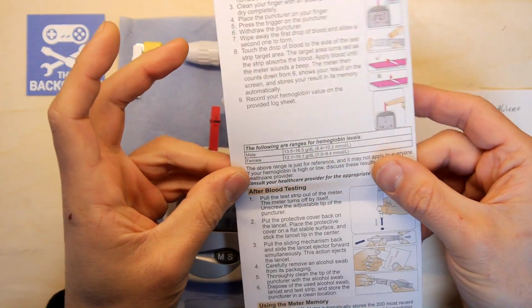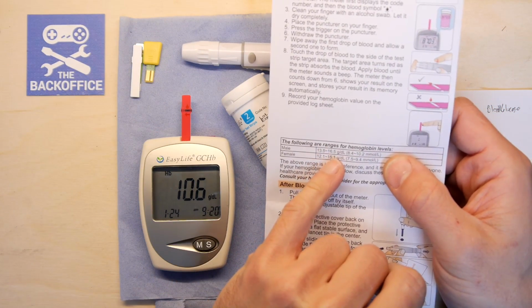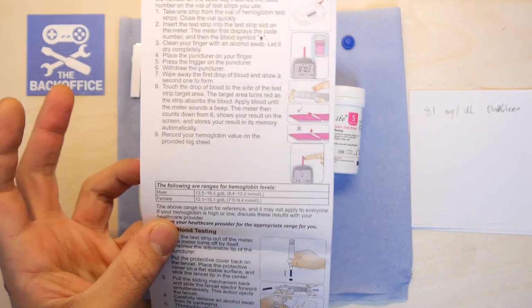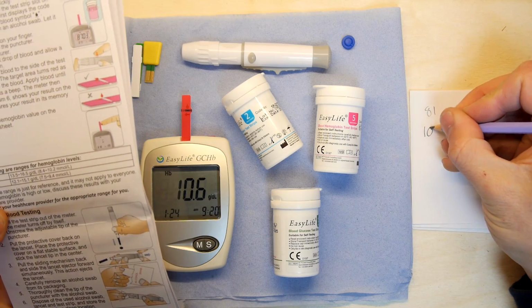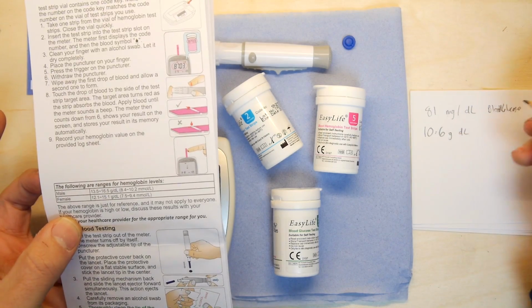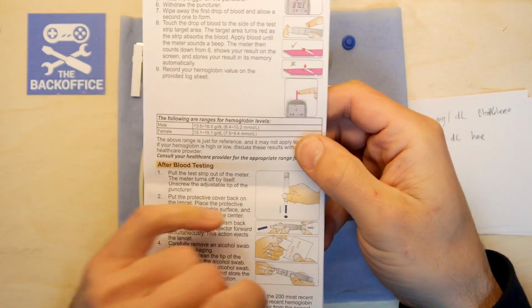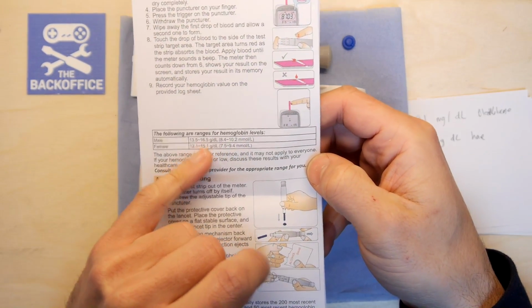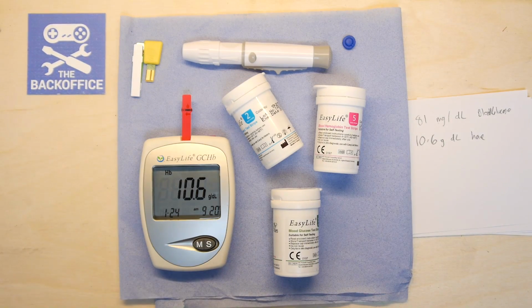So the following are ranges for males. 13.5 to 16.5. Oh, 10.6 for the hemoglobin. That's not good. 10.6 g/dL hemoglobin. Well, there you go. That's a result that you don't want. That means maybe you need a bit more iron in your diet. So I'm going to go suck on a handful of screws.